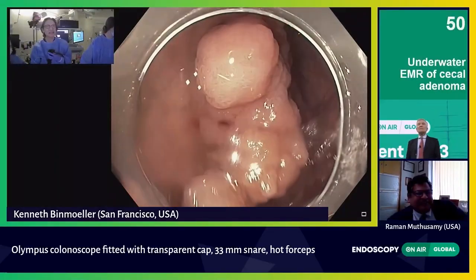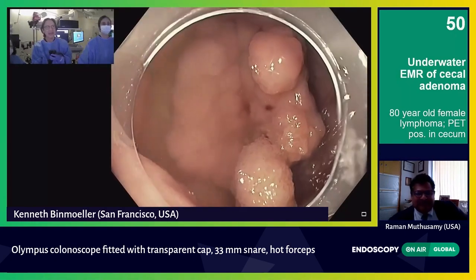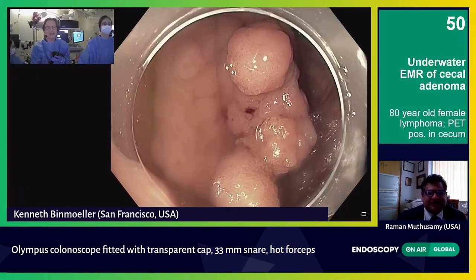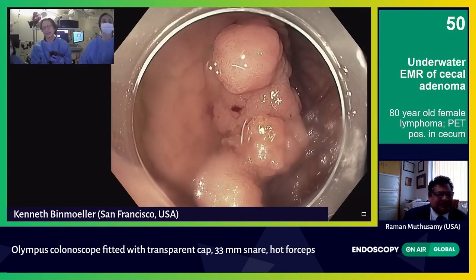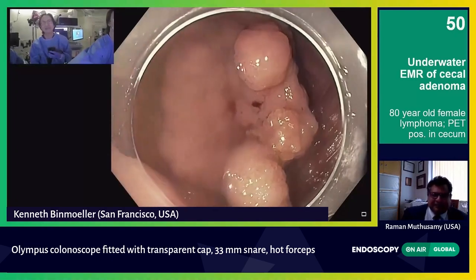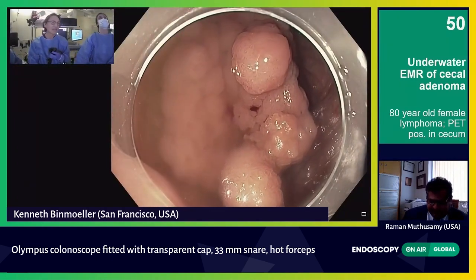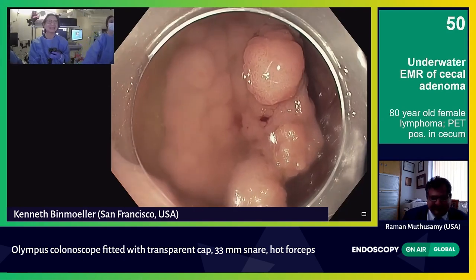You can see a lesion here in the cecum. I just arrived, so I'm just looking at it now. I'm giving gas CO2 just to show you what it looks like with the gas view, and we'll go underwater in just a moment. It was advertised as 2.5 centimeters, but it looks a little bigger than that — I think you will agree.